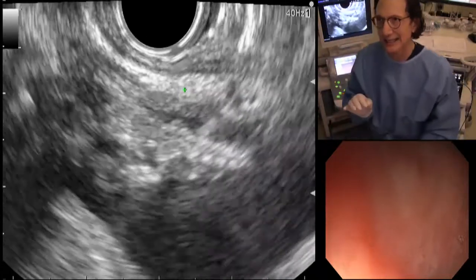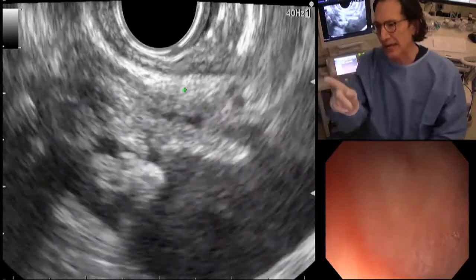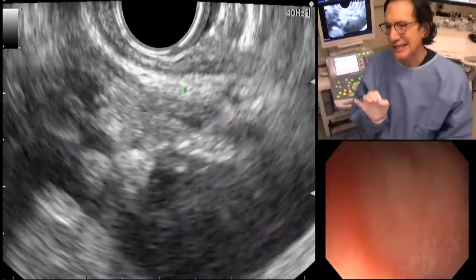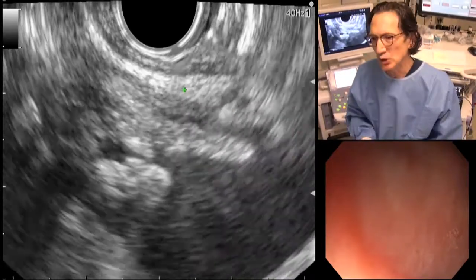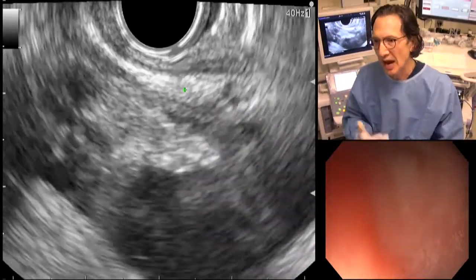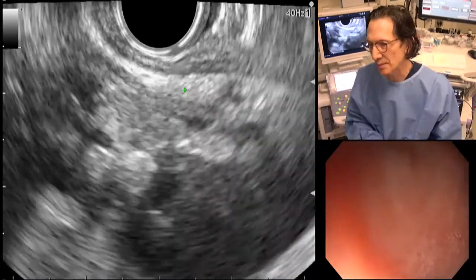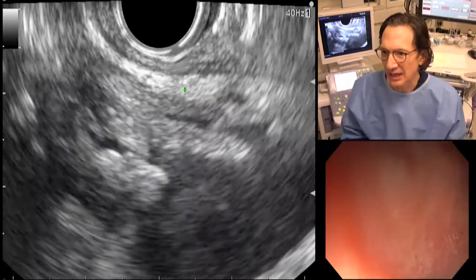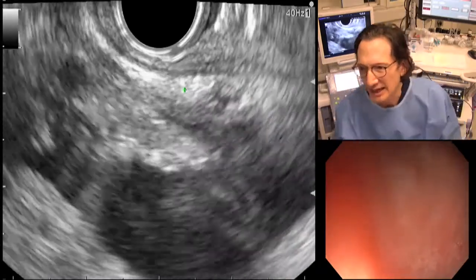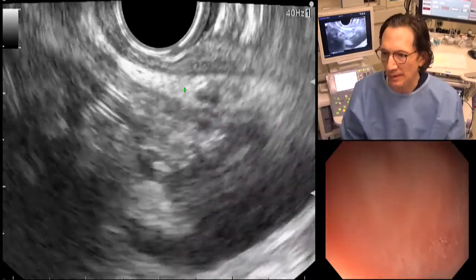Now, there's a few things we can do to facilitate this procedure, and one of the reasons why I selected this case, we can put the lights up a little bit more in the room so that the audience can see me. I selected this case because I think this is a great case to start with when learning internal gallbladder drainage, because you have a safety net. And the safety net is that this patient has a cholecystostomy tube in place. So we just have a backup here just in case anything goes wrong, that we do have drainage of the gallbladder.